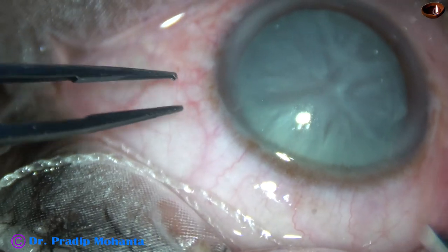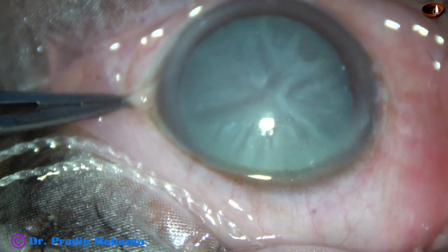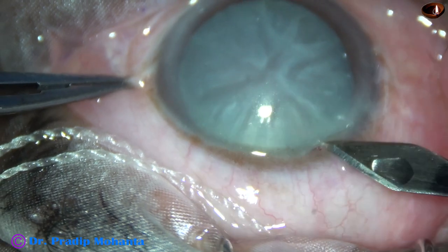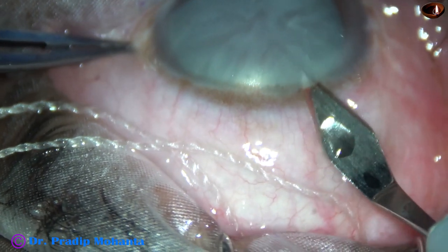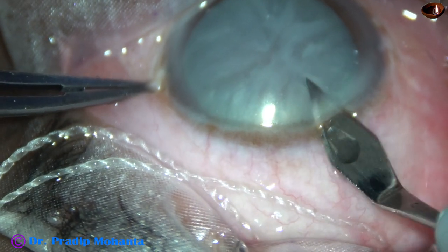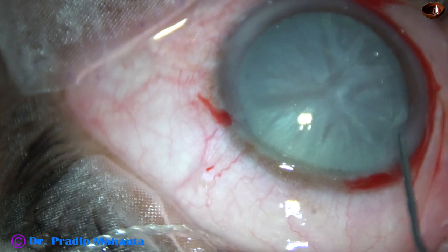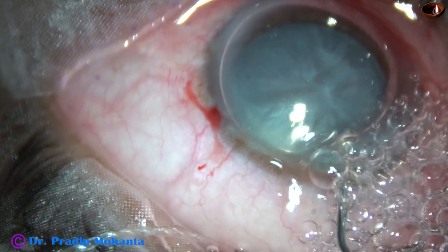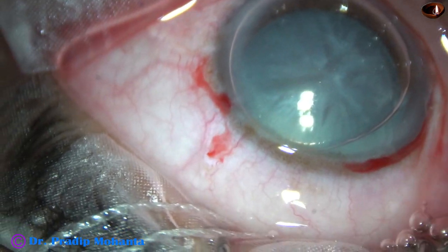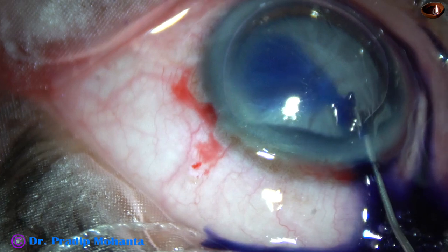This is a tough case. The patient is an 80-year-old lady. The challenges we have in this case are: this is an intumescent cataract with weak zonules, the nucleus is very hard, and because of peribulbar block, the eyeball has turned towards the nose. This is the left eye of the patient. Fortunately, we have a well-dilated pupil in this case. Let us observe the surgical steps.